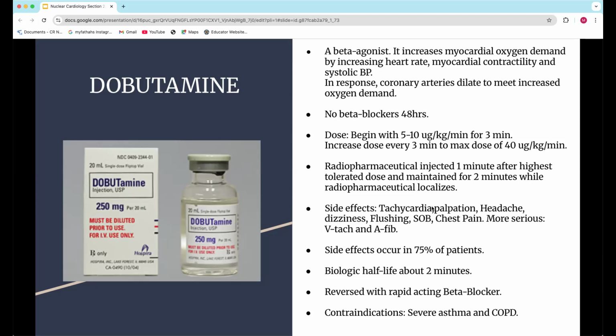So this one is not a popular one to use. And you probably won't see it in nuclear medicine a lot currently. There may be some of your facilities that still use it. It's used a lot in some other stress testing that's not in nuclear medicine, and we've used it still for stress tests before, but it's not seen quite as much.